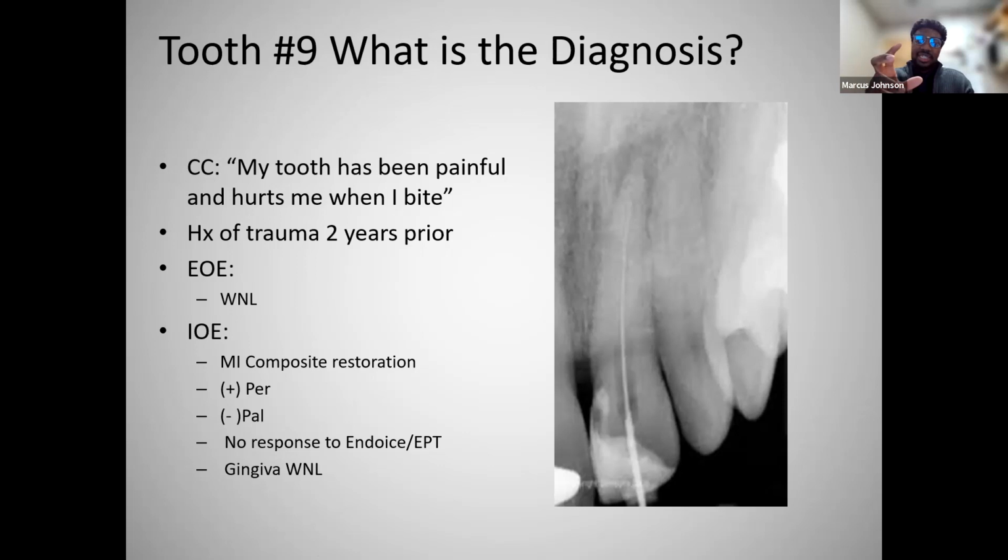However, there is something of major importance that is missing from this photo, and this is just to make a quick point. There is no rubber dam clamp on this tooth. Now, obviously, oftentimes I ligate teeth with wedges or some sort of floss to get good isolation, but I still get a lot of cases flowing through my practice. When I place the clamp on the tooth, the patient says, "Oh, doc, what's going on? What is this?" I say, "This is a rubber dam. This is pretty much a standard of practice. This is going to help isolate the case." I've never seen that before, but they have 3 and 4 root canals. So as long as their practice is still out there, I guess we'll keep thriving.